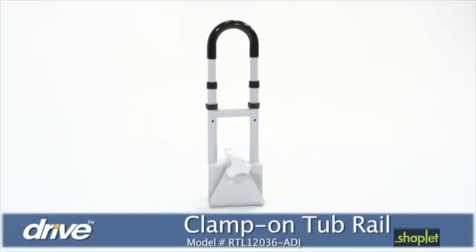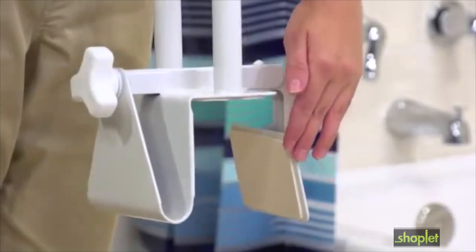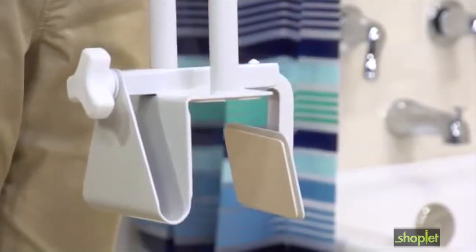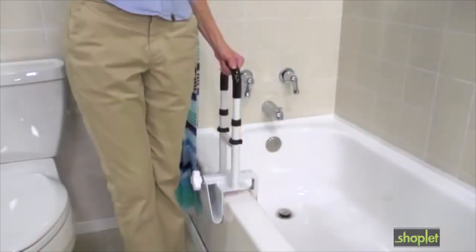A simple safety addition that offers security and stability in the bathroom is the Bathtub Safety Rail by Drive Medical. Without needing any tools, this adjustable width clamp attaches to the side of any non-fiberglass tub by turning the locking mechanism.